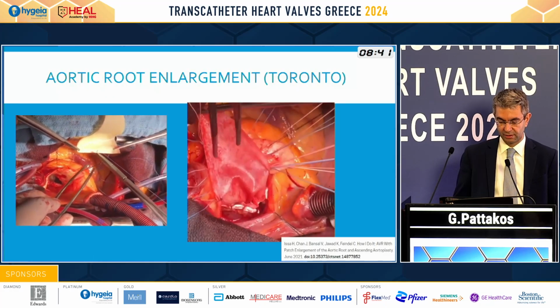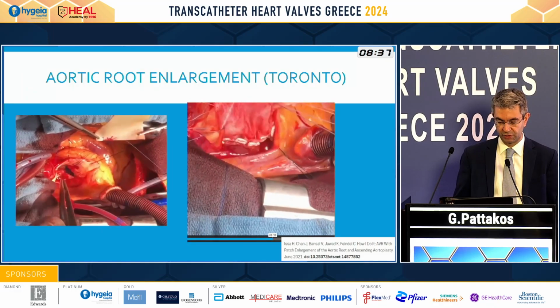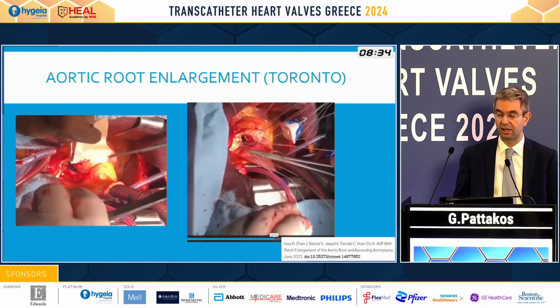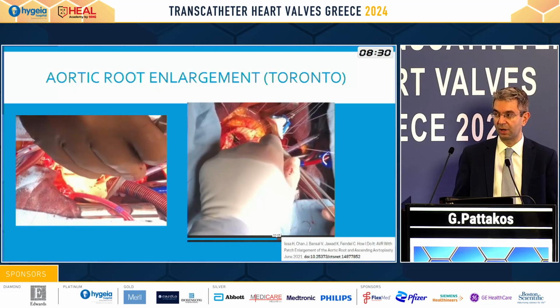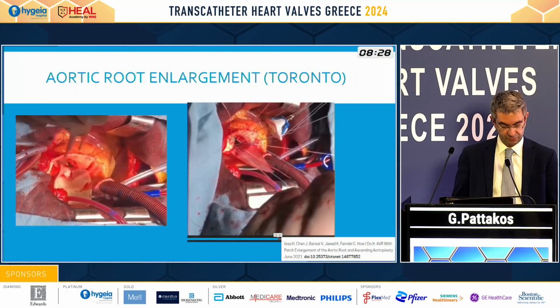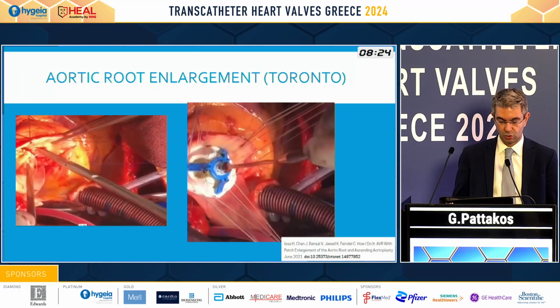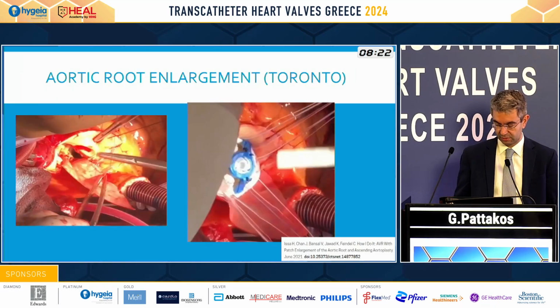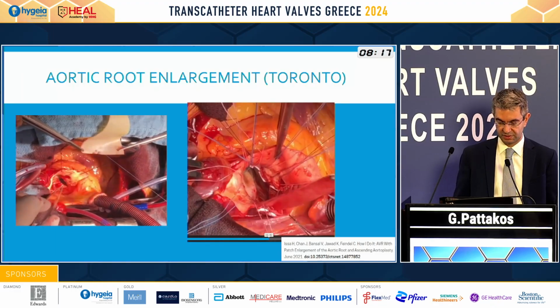So this is one of the nicest videos I found. I don't have as nice a video as they made out of Toronto, but you can see it's not that complicated. And I think the main barrier for most surgeons to do this is that if you've never seen one, you're probably not going to do one. But if you've seen one, you know that it's relatively straightforward to open the annulus, sew in a patch, and then it's just a matter of someone taking you through your first one, and then see one, do one, teach one, pretty much for these cases.